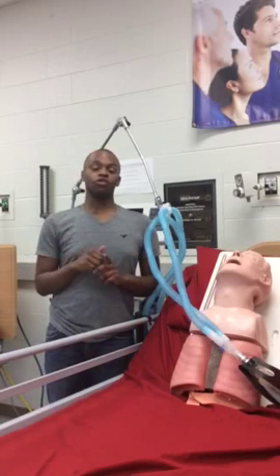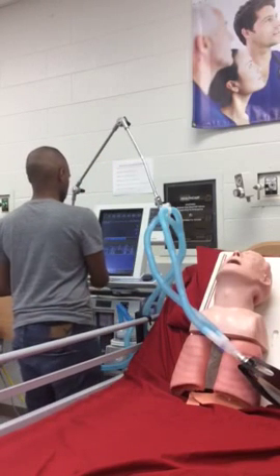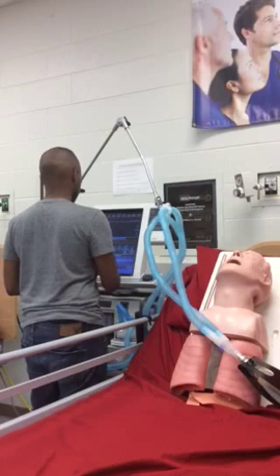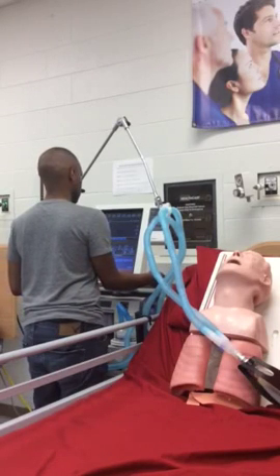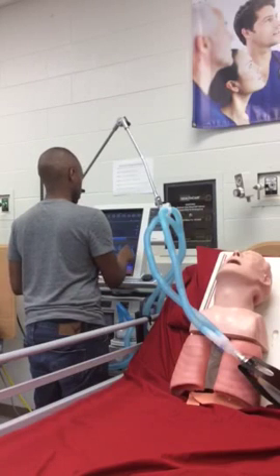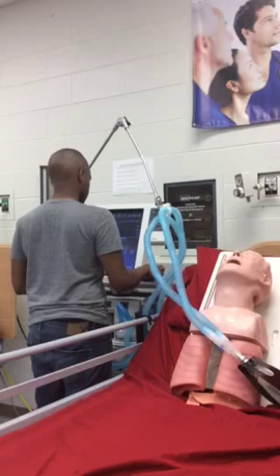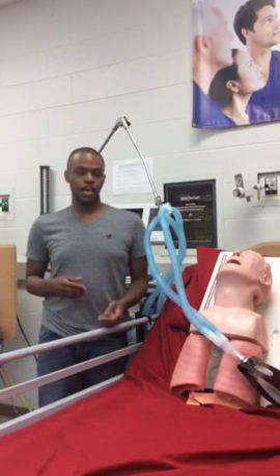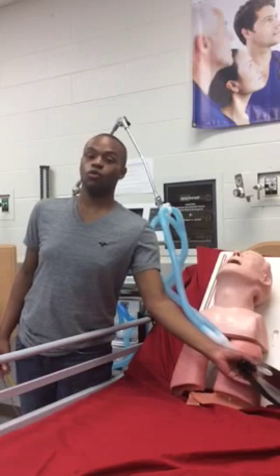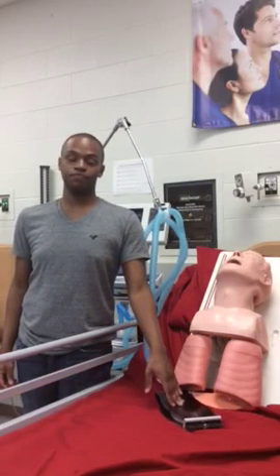We're going to flip her over to a totally spontaneous mode. Dr. Smith told me to put her in spontaneous pressure support, 5 PEEP, and 5 pressure support, FiO2 of 30. Alright, so we have her switched over now, and now she's going to be doing all the work herself. I can now get some numbers from her.